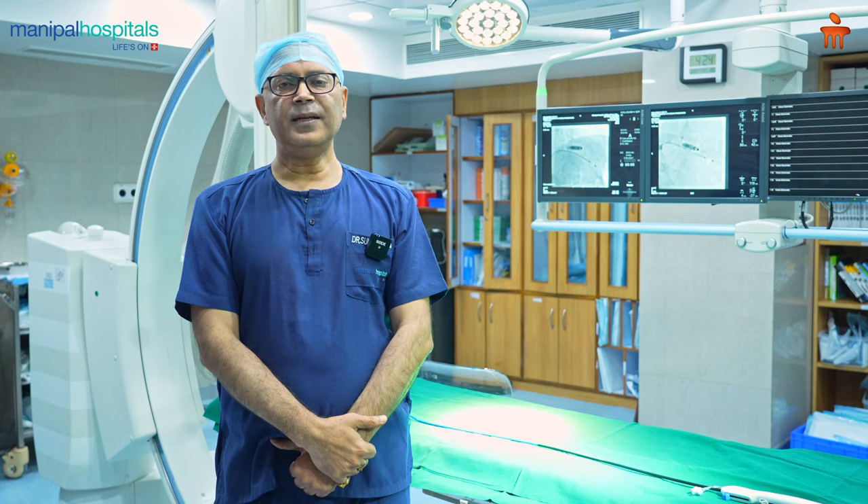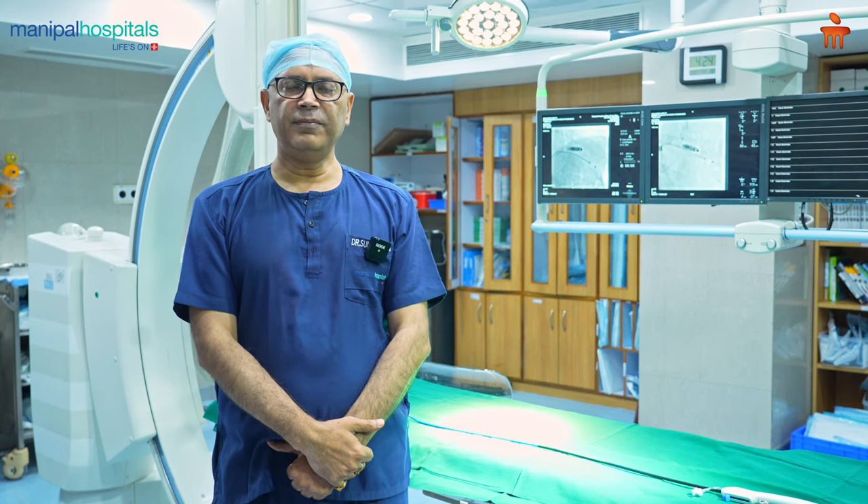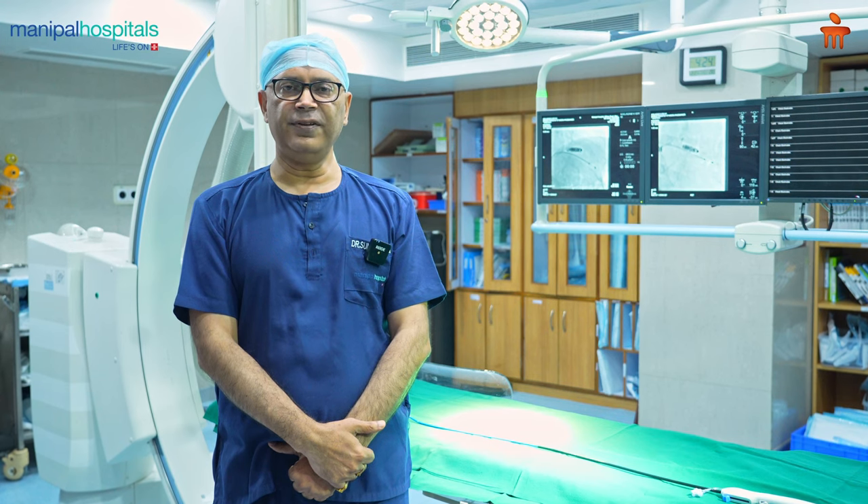As we all know, pacemakers are needed to improve the heart rate of the patient and it prevents them from collapse or breathlessness or heart failure.